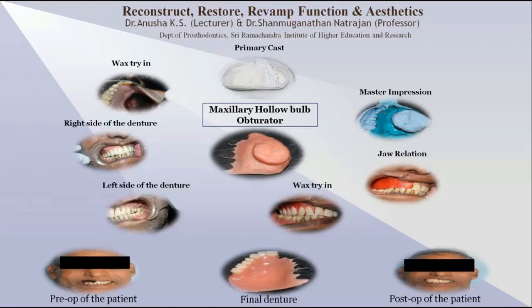The patient was asked if there were any difficulties. The patient said that he was very happy with the denture and he was able to perform his functions very well, like mastication. The patient was also able to socialize very well because of the new denture, and he was very happy with the aesthetics.